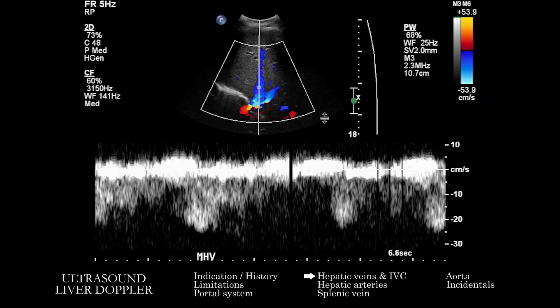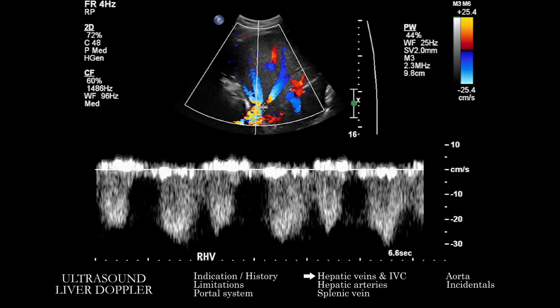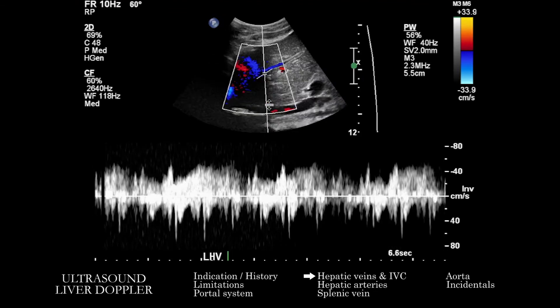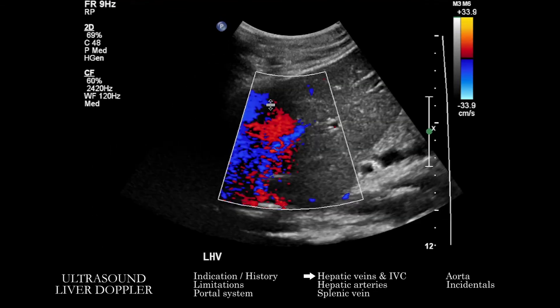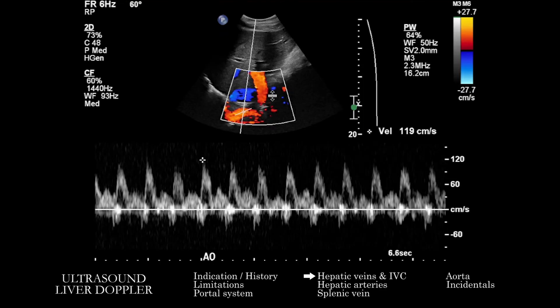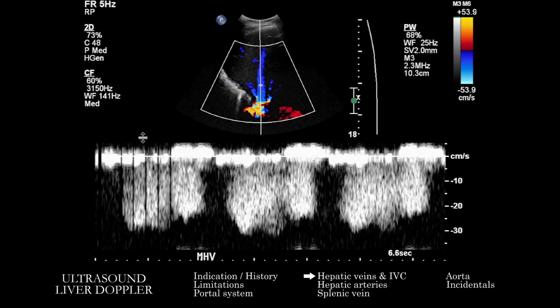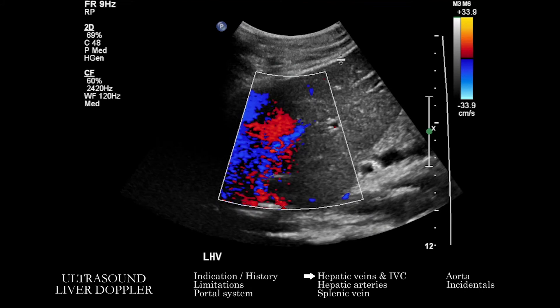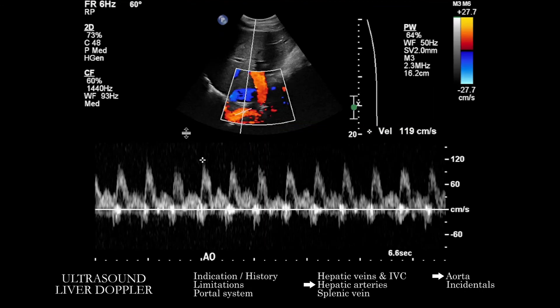We're going to look at the hepatic venous vasculature — the right, middle, and left hepatic veins. It's also worth mentioning that sometimes this exam is done concurrently with a right upper quadrant study, where you may have more grayscale images that are useful to correlate between the two. Having finished the hepatic venous vasculature area, we then head into the aorta and the hepatic arterial system.